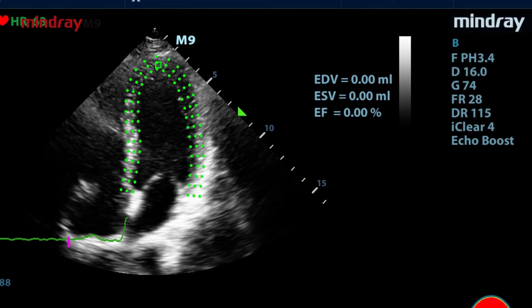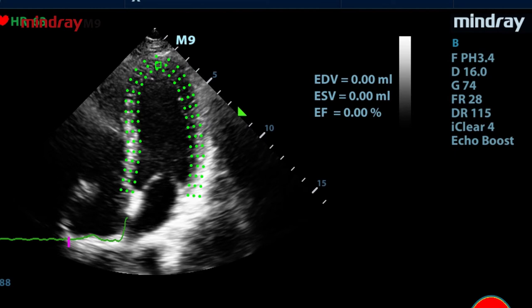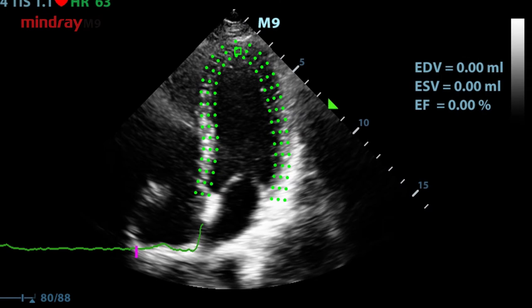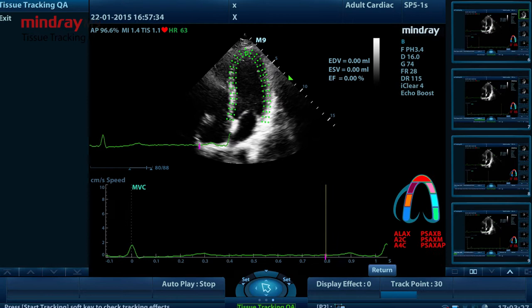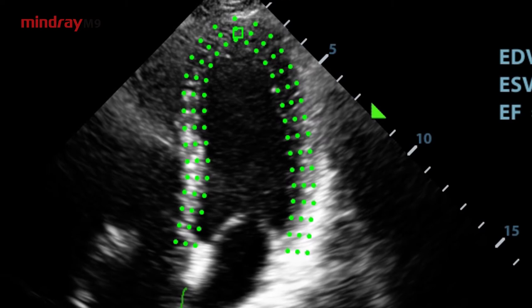Use the cursor to set the reference point. After reference points are set, the system will display the boundary of the endocardium and epicardium. If the trace result is poor, click reload on the soft menu to retrace the reference points, or make fine adjustments to the points using the cursor.